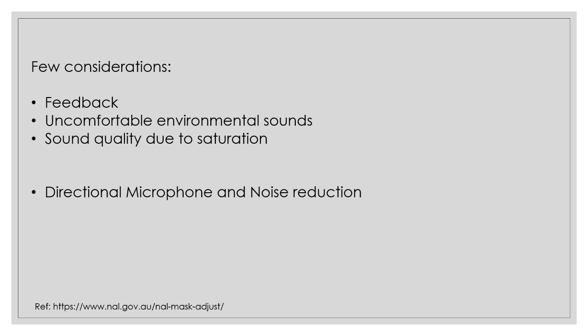Why not just continue with mask mode? Number one, it is going to drain the battery because we have kept the directional microphone and noise reduction to the fullest. So your hearing aid is doing a lot of work, which means it consumes a lot of the battery. So you're going to lose your battery life.